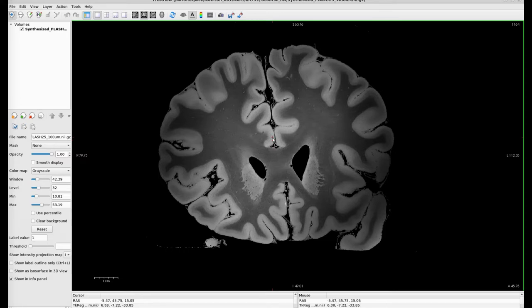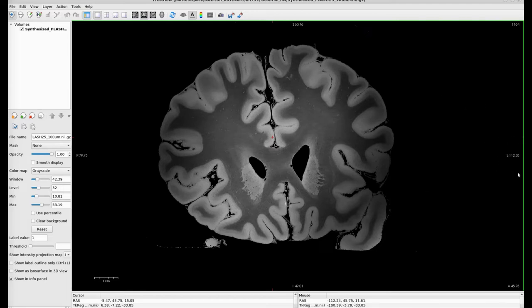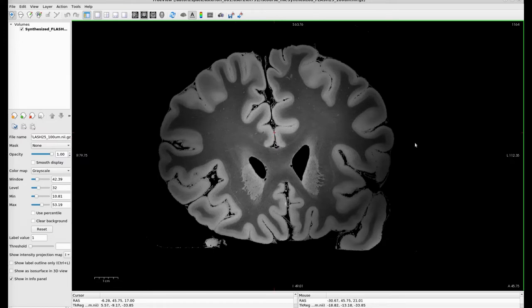We're going to scroll in — first I should tell you that the plane we're looking at here is coronal. In radiology, when you're viewing volumes, the brain is usually viewed as if you are looking at the patient. So as you can see, this is the left hemisphere, denoted by the little 'L' on the right. That's something to note — the brain is kind of reversed to how you would typically expect it to be. So this is the left hemisphere and this is the right hemisphere. We're going to scroll in the posterior direction of the brain and I'm going to point out some structures to you.